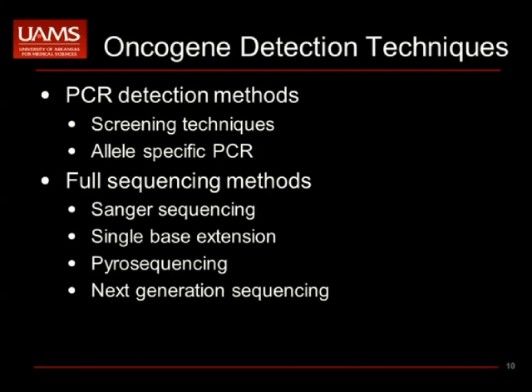It's expensive. It's too big. We don't need that much information. The information is information overload. And we know that there are problems with the starting material that you've heard about over and over again. So I think we will see the same sort of trends. We will see applications of next generation sequencing, and certainly the targeted approaches are going to be very powerful and strong. But the whole genome analysis, decades away for practical purposes.